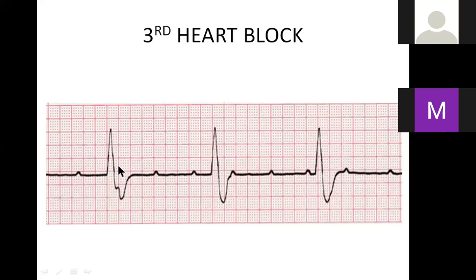This is a ventricular rhythm, AV dissociation. Heart rate is 300, 150, 100, 75, 60, 50, 40, 30, 20. Usually the ventricular rate is about 30. So this is severe bradycardia. Whenever you see a strip of severe bradycardia, heart rate 30, 40, think of third degree heart block. Okay, this is third degree heart block.